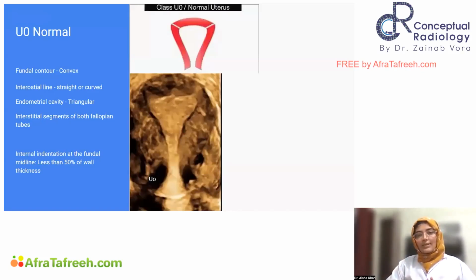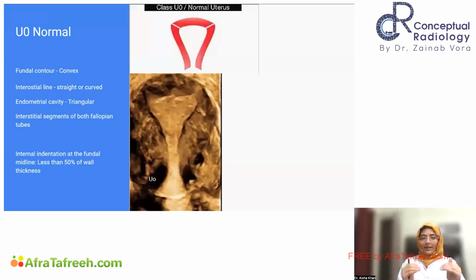So what all is there in this? First of all, external means fundus. So the external fundal contour is convex. The interostial line is going to be straight or slight dipping is allowed. Don't worry. Endometrial cavity, as you can see in this diagram, is triangular in shape. And both the tubes have their interstitial segments. Internal indentation in the fundal midline less than 50% of wall thickness is permissible.